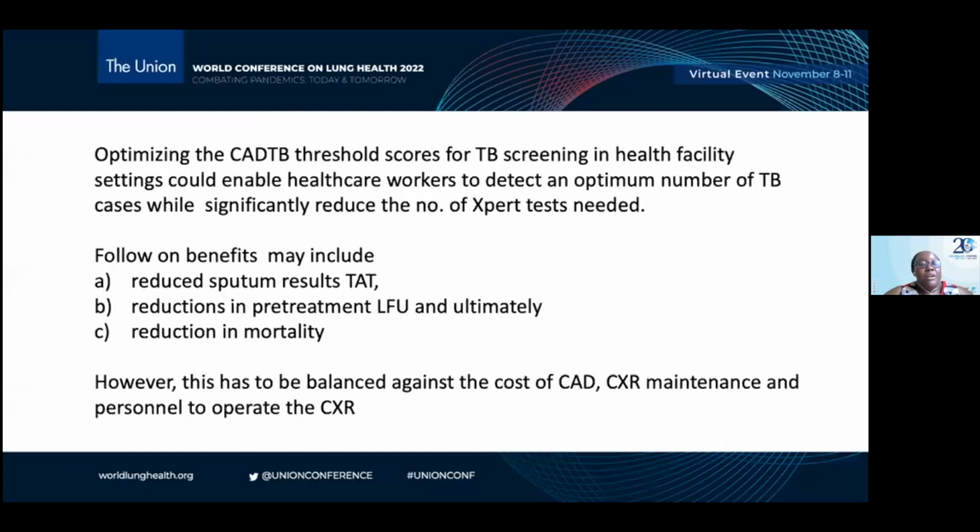What we learned from this study is that we need more data from the Ugandan setting on optimizing the CAD4TB threshold scores for TB screening in the facility setting, so that we can enable our healthcare workers to detect an optimum number of TB cases while significantly reducing the number of Xpert tests that are needed.